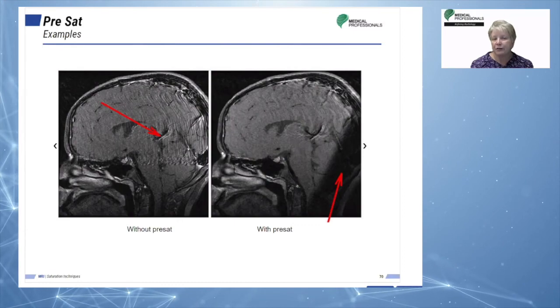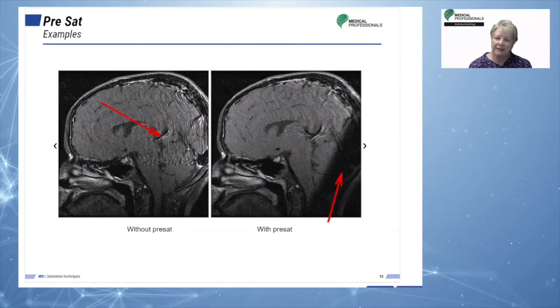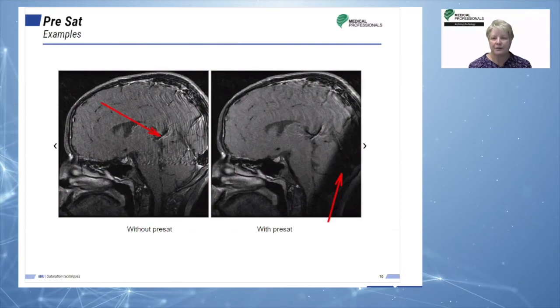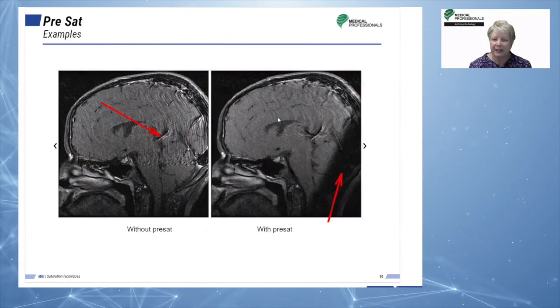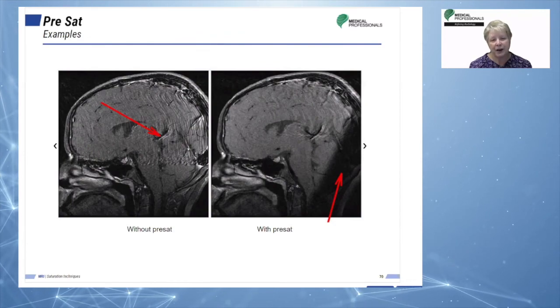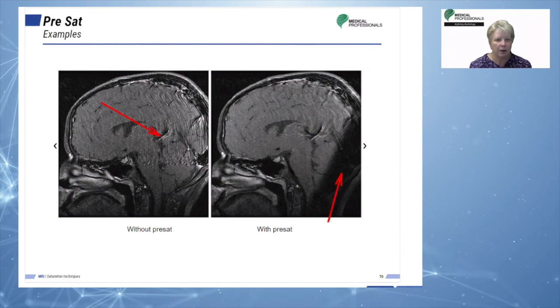Therefore, they do not contribute to the signal. And the motion created by the signal is also not as noticeable. Now, we have not gotten rid of that motion completely. It is still there, but it's not as noticeable, and it does help with the image quality.